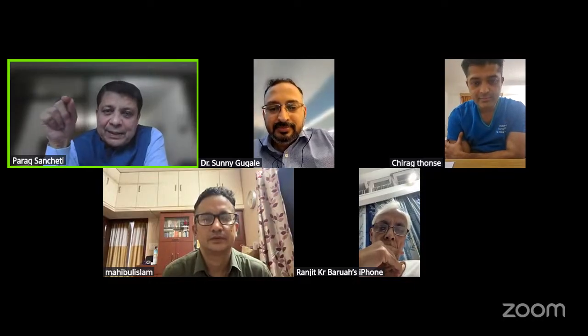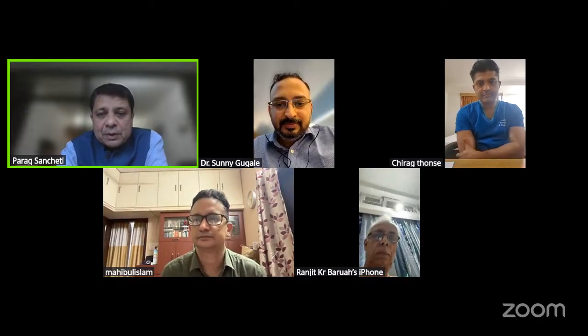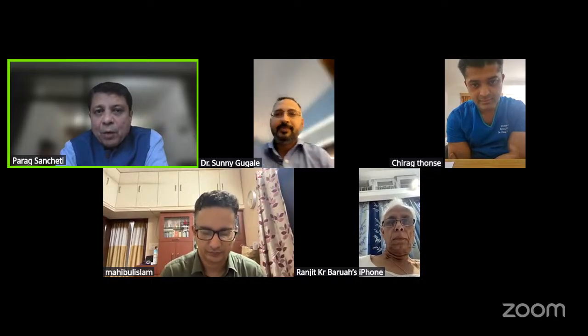So in case I can see the tip where I have lost the graft, where it is amputated prematurely, I will try to retrieve it and do it. If not, then of course we have to consent the patient for either the peroneus longus same side or the quadriceps soft tissue. Again, I think it's a good graft. You can get good length with the quadriceps central strip. So I would fall back to one of those two grafts after asking the anesthetist or somebody to go and inform the patient. So that is the way I would bail out of this situation.